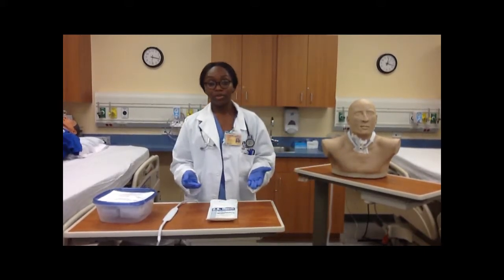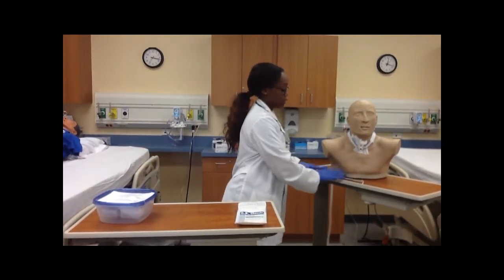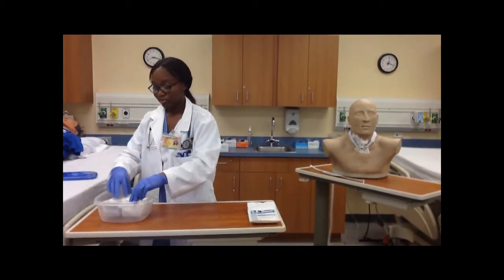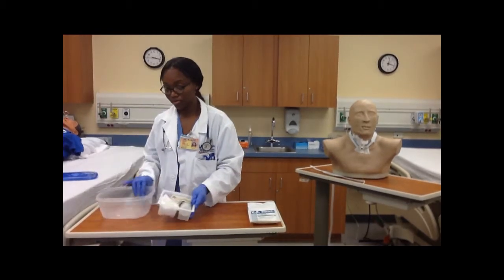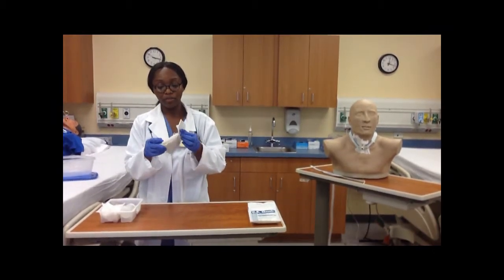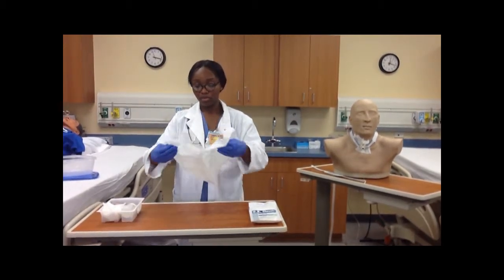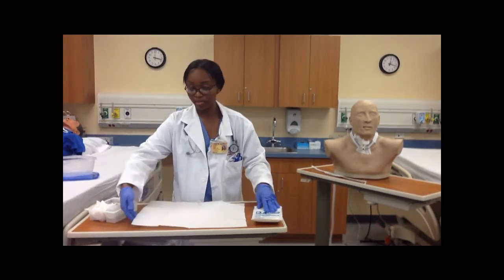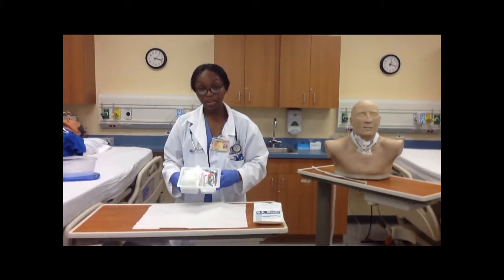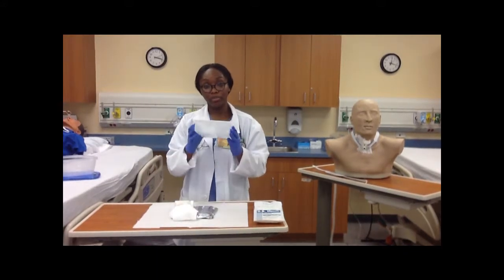Now you're ready to set up your sterile field. I'm just going to place my tracheostomy necktie over here so that it doesn't get in contact with my sterile field. In my kit, I have this sheet here, and you just want to make sure you handle it from the outside because I'm going to be creating a sterile field. I don't want anything to contaminate it. Everything inside my tray, I will just dump onto the sterile field. Make sure not to throw the tray away because you'll be needing it for cleaning.